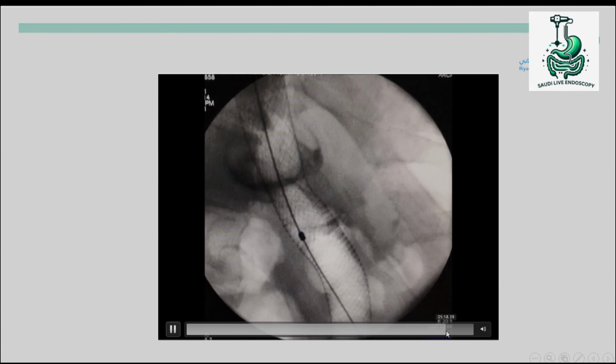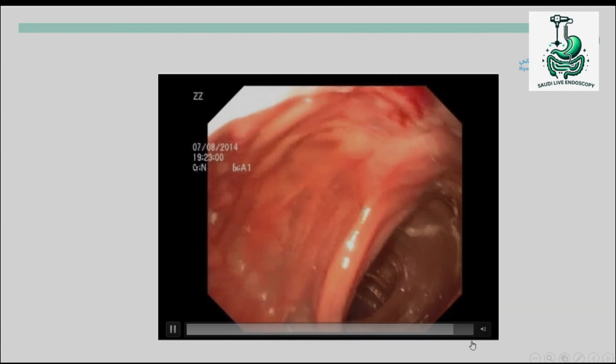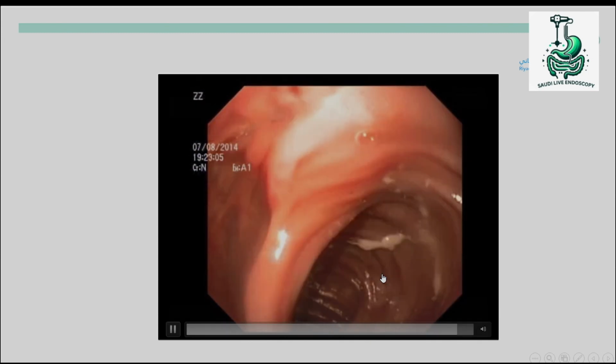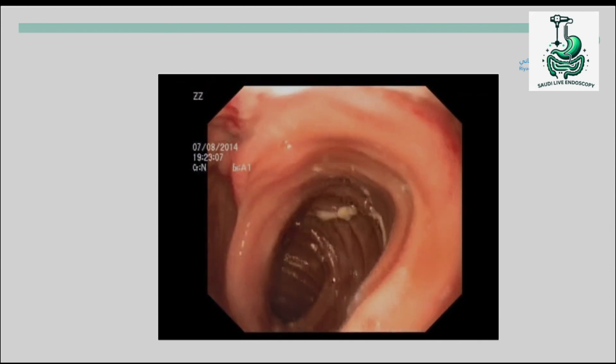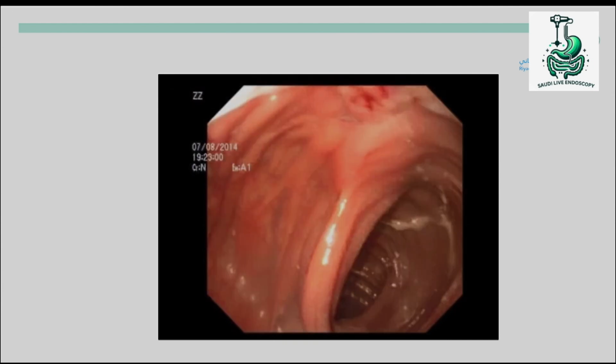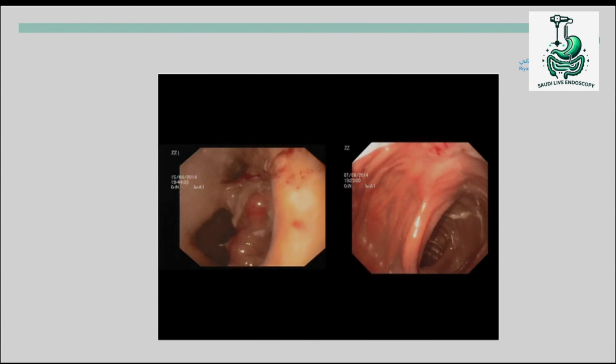And then we put another one of these large megastents for another 6 weeks. And then when we look now, we have this lovely view. It's completely healed. And it shows you that, yeah, with persistence and with really approaching the patient differently according to the timing you enter, his general condition, if it's chronic or not, you can achieve very good results.